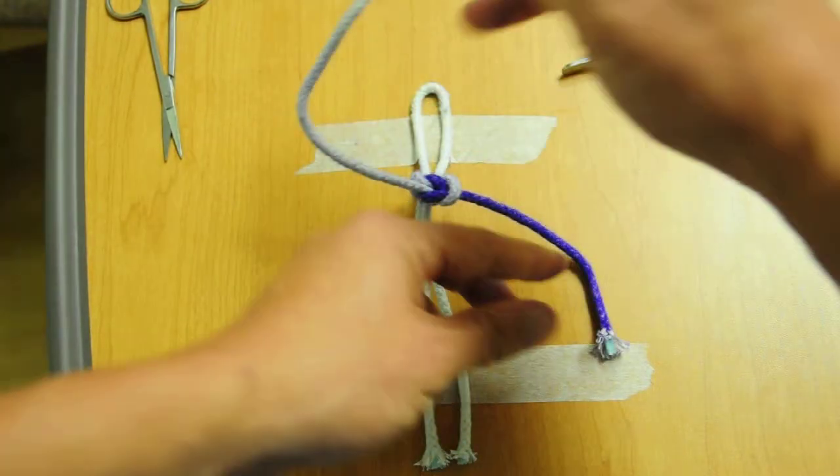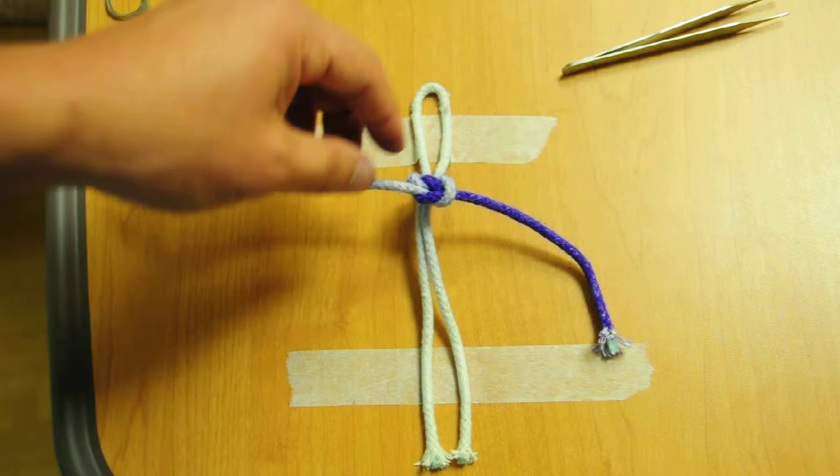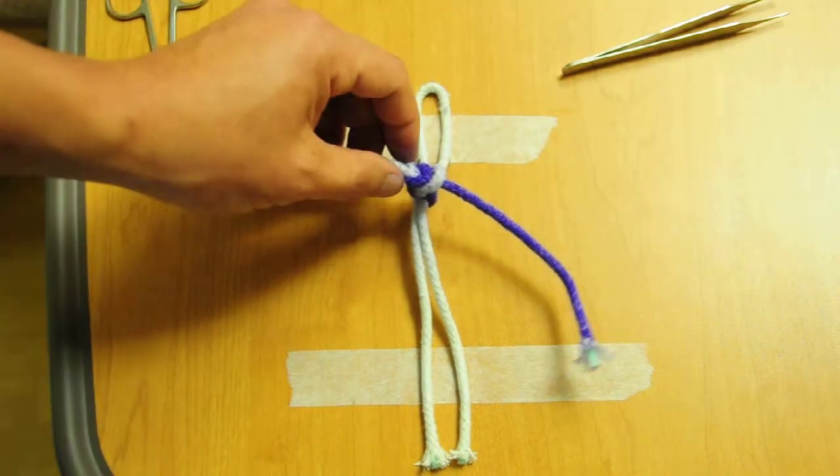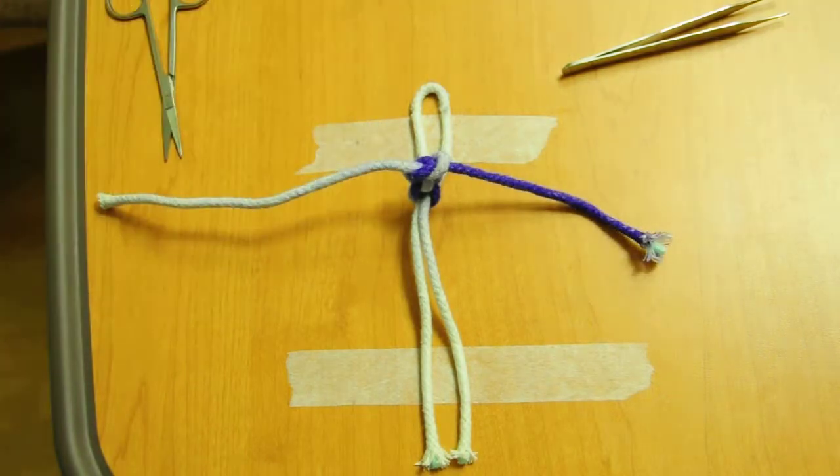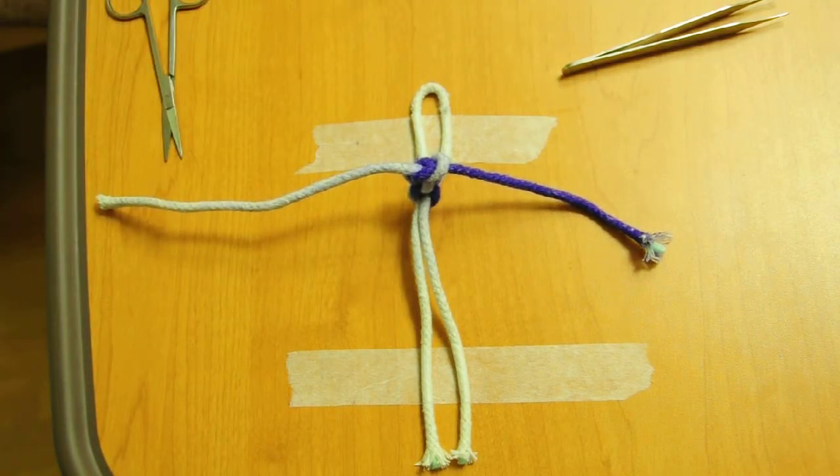This is all in an ideal world where you're not down in the pelvis. So that is your right-handed one-handed tie. But we'll go into more advanced techniques with actual suture in a second and more practical knot tying solutions.